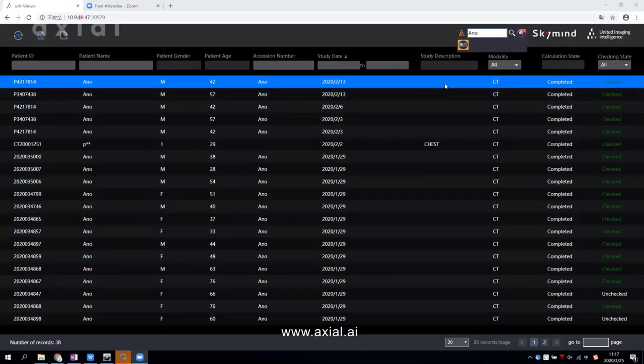Today, I am going to show you how to use Axial AI to identify and analyze COVID-19 patients.